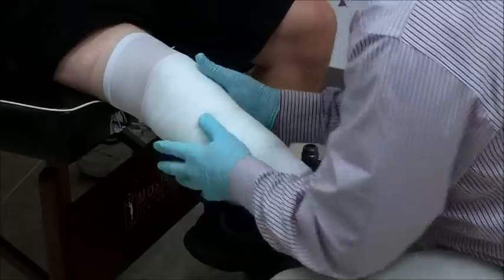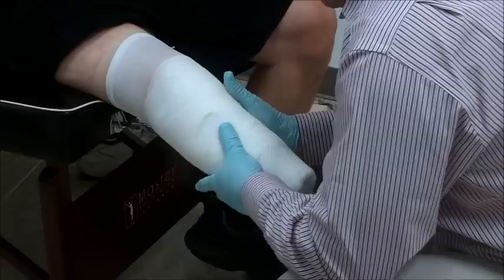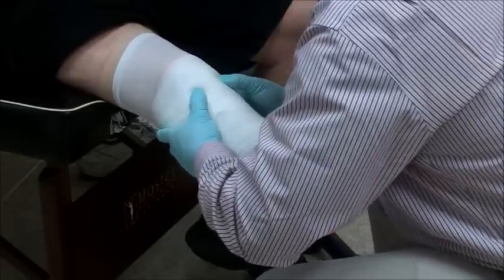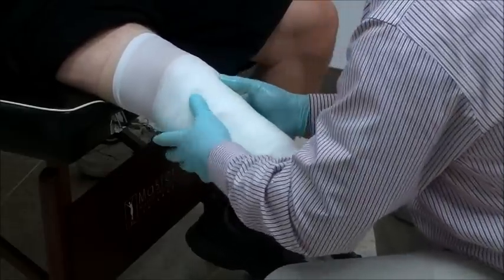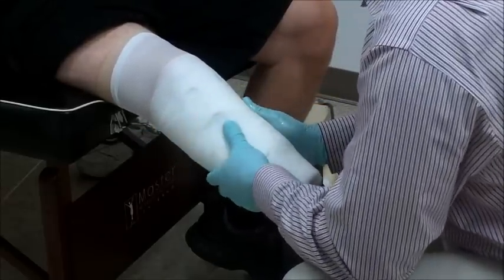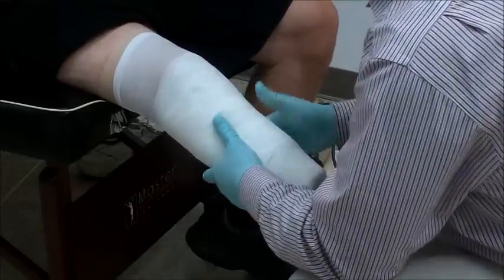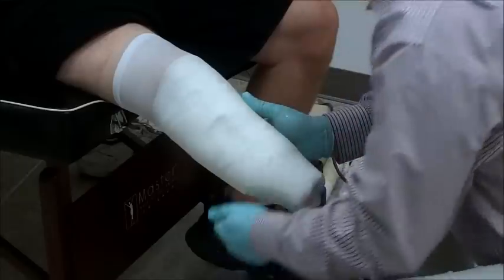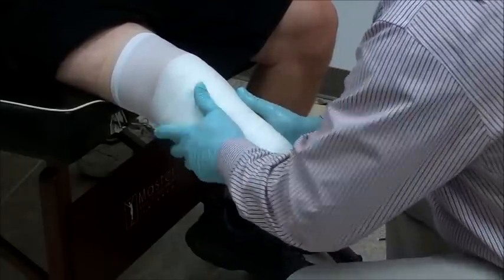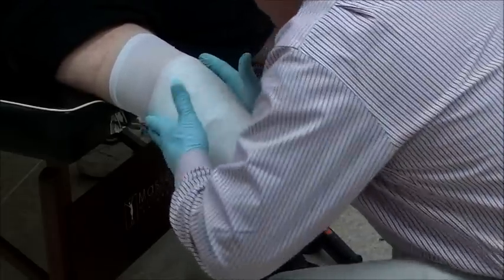Underneath the fibular head, I'll get a little bit of shaft loading. Because I've got an ML, if I'm loading up the medial tibial flare, I need to load the lateral side as well. I'm not worrying about the AP. I'm going to find this patella and give myself some dimples so I know. But I do not load the patella tendon — it's really strong and it fights me. So if I'm sticking because the material is going off, I get my glove wet to make it more slick so I can move around and get the cast that I want.